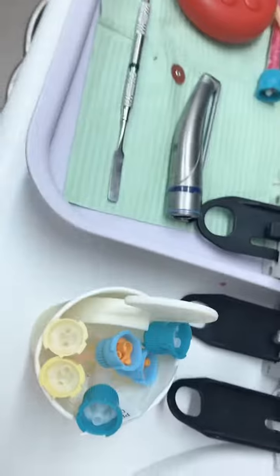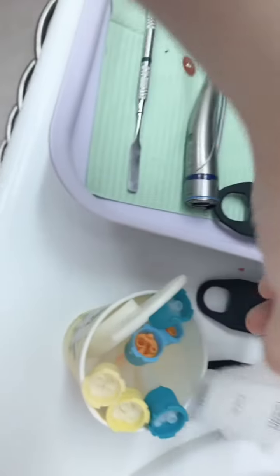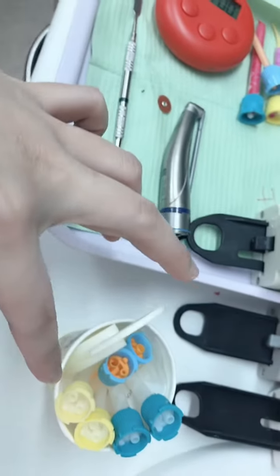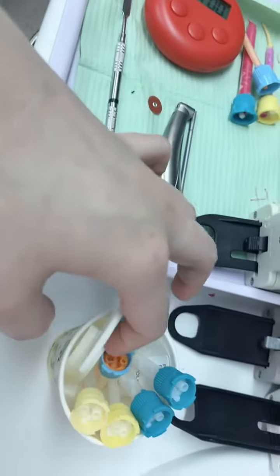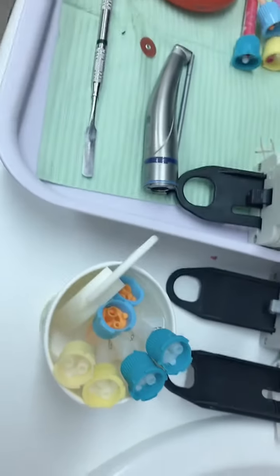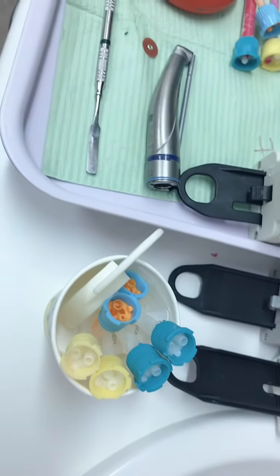The next thing to do is to refill the cups for the next patient — for the next crown. So start from the beginning: we have the sticker, we have the bite cartridges mixing tip, we have the light body mixing tip, we have the temporary mixing tip, and we have the triple tray. This is all we need for a crown.